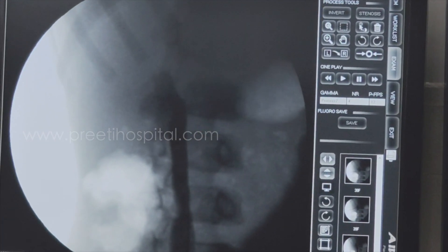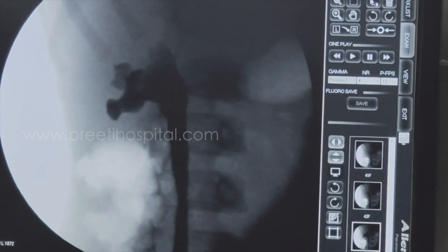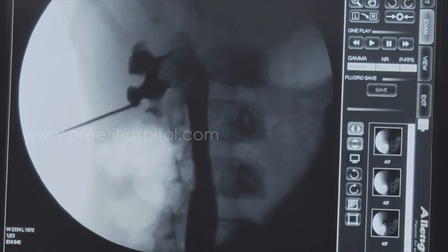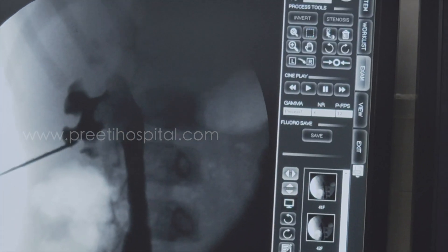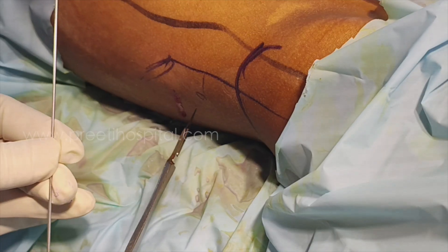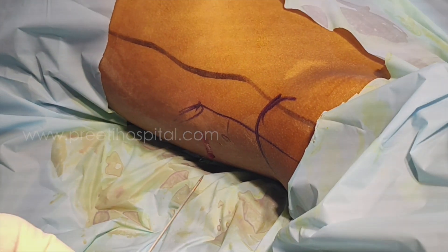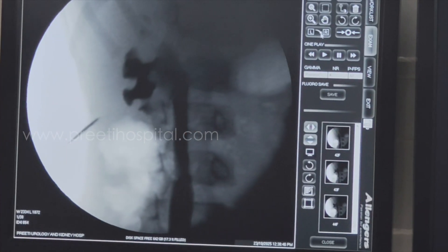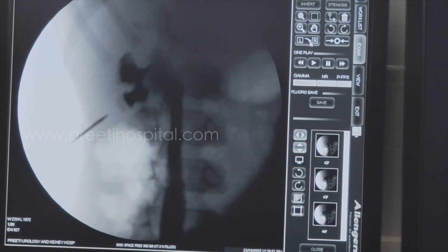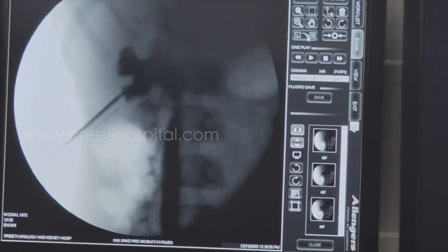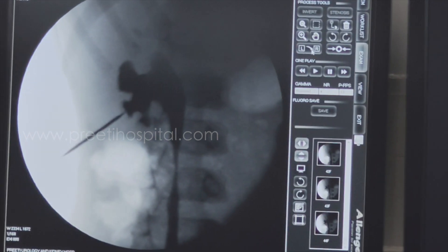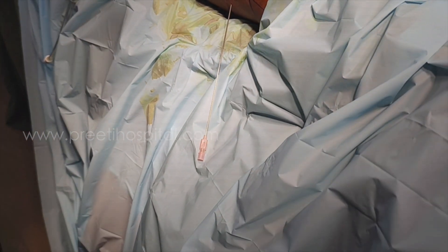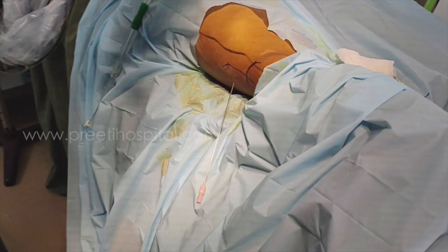So you go horizontally. The moment I put within one centimeter, the kidney is not moving and the calyceal cupping is deforming. Only one centimeter has gone inside — it can be dangerous. You need high pressure on the sheath. At this level you have to check whether it is in the correct position or not. Now what will you do? At 5 degrees you tilt — same position. At 10 degrees — it has come a little down, meaning you are more anterior. At 15 degrees — it is coming more down. At 20 degrees — still more down.